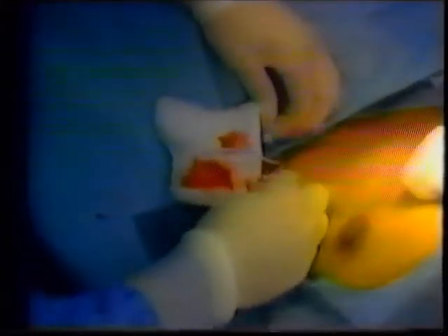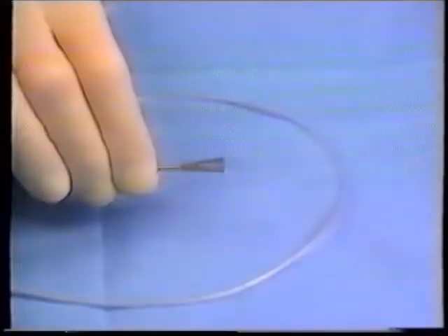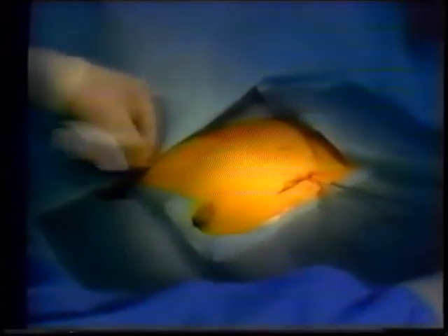Withdraw the split sheath and, grasping both handles, peel the handles apart leaving the catheter in place. Make sure the catheter is not dislodged from the vessel as the sheath is removed. Insert the trocar subcutaneously partway along the tunnel track. Remove the stylet, taking care that the catheter is not withdrawn from the vessel, and then slide the catheter onto the trocar end. Pass the trocar and attached catheter through the subcutaneous tunnel into the port pocket after removing the packing gauze. Remove any kinks or slack in the catheter by checking the track and insertion site.